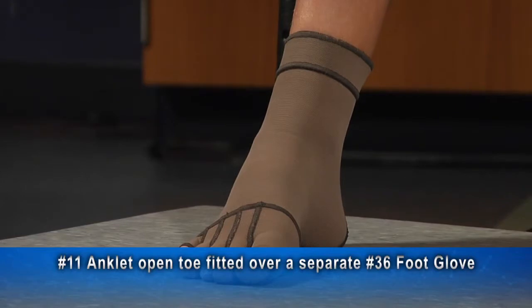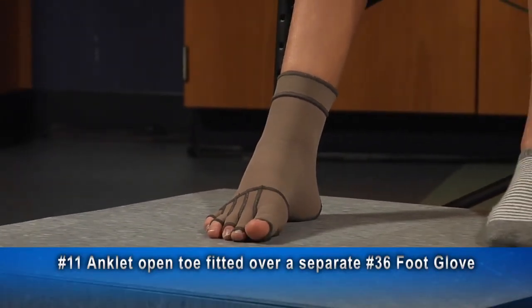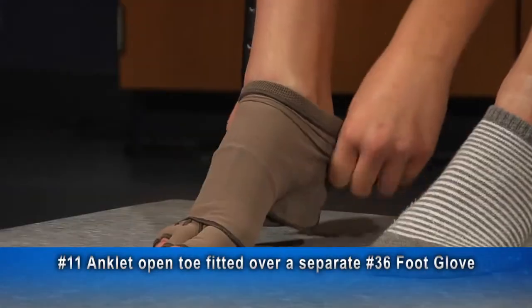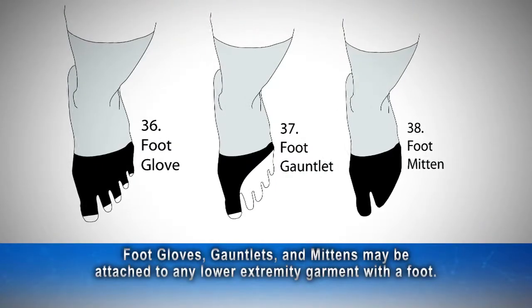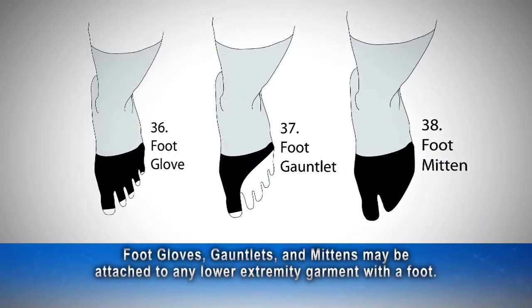Most customers want to have the foot glove attached to the stockings like the example we saw previously. Occasionally, you may want a separate foot glove and open-toed stocking to fit over it. This is an open-toed anklet fitted over a separate foot glove. Foot gloves, gauntlets, and mittens may be attached to any lower extremity garment with a foot.